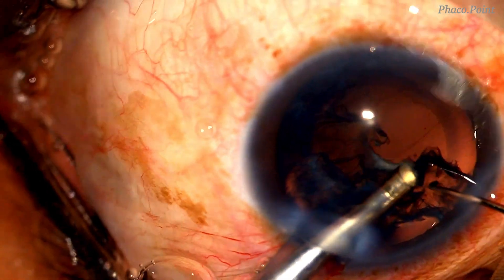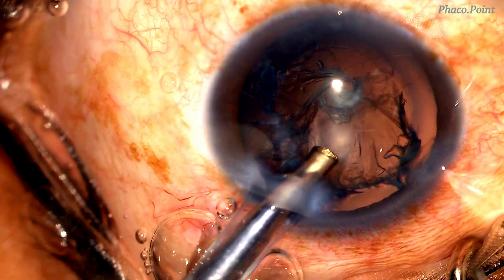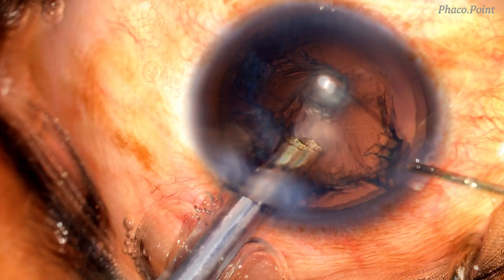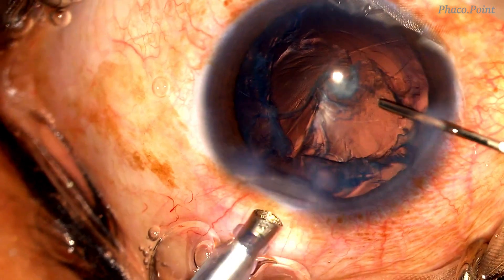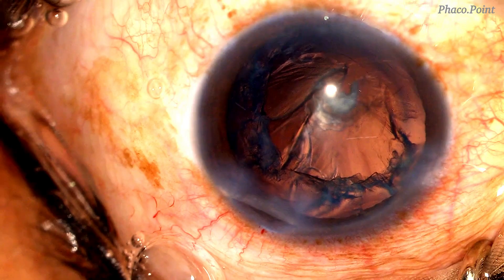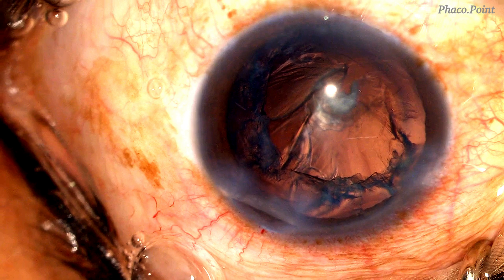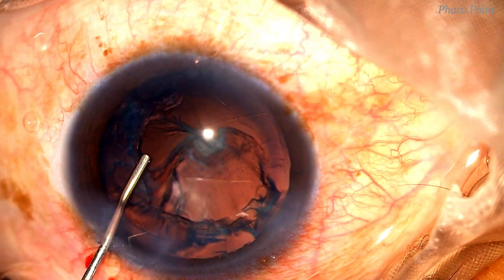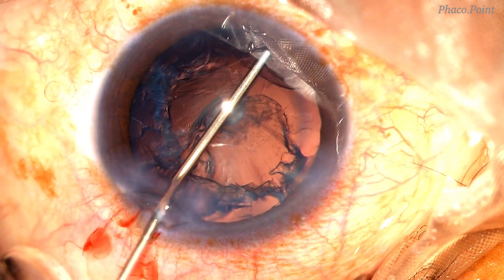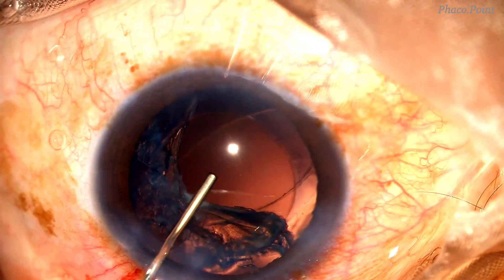As the last bit of the epinucleus starts to get aspirated, you will be able to see the classic polar opening in the posterior capsule. A visco-fluid exchange is performed once more following completion of epinucleus removal. Thus far, we have been successful in removing the endonucleus as well as the epinucleus without any disturbance to the vitreous or any dropping of nucleus or epinucleus into the posterior segment. More viscoelastic is introduced to prevent vitreous herniation during cortex removal.